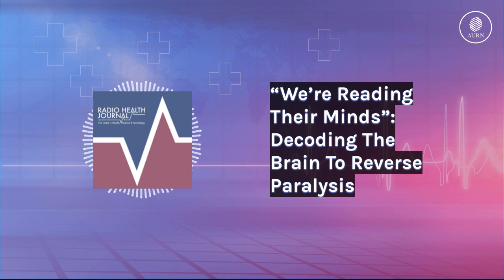Once the team was able to distinguish the movement signals, they studied the specific neurons to see how often and quickly they fire and how strong each burst is. Once all of that information was compiled, they began to teach this language to an AI system. We used to use something that was kind of an early crude technique, and now we use more advanced neural networks that really try to behave like the human brain in a sense, but it's running in a computer, and we learn these patterns. And then someone can simply think about movements they would like to achieve. We know what they're thinking about. In a way, we're reading their minds.